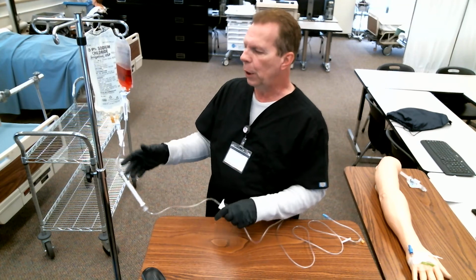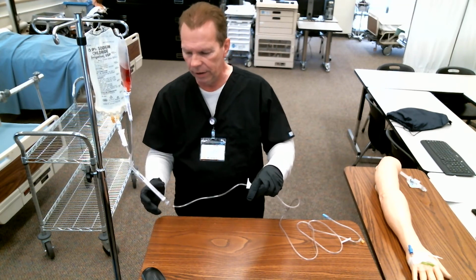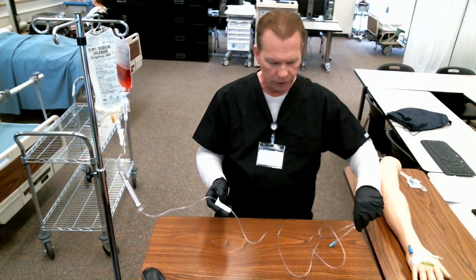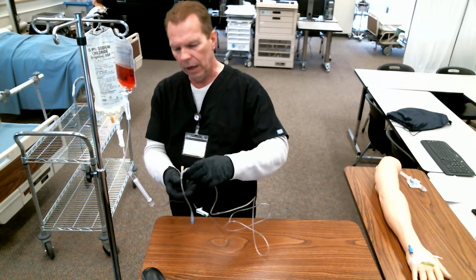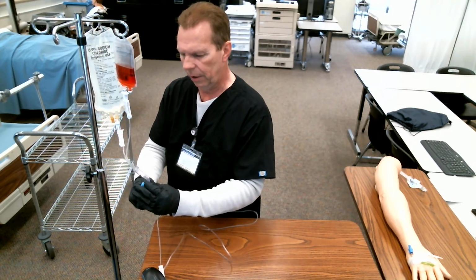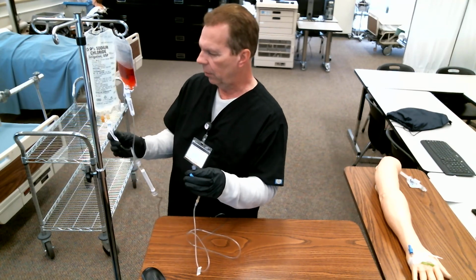Okay, so what I want to do is, again, just like a regular IV, this line, this drip chamber and all this is full with air, and so we've got to purge that air out of here. So what I'm going to do is pull the top off there, protecting those, make sure it stays sterile. I'm going to open the saline.